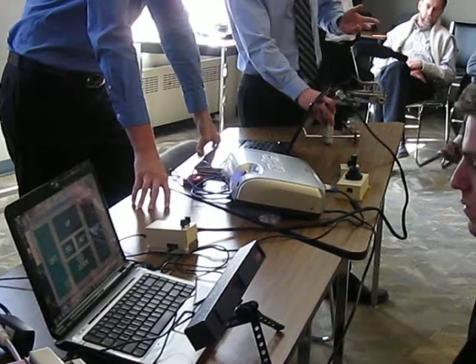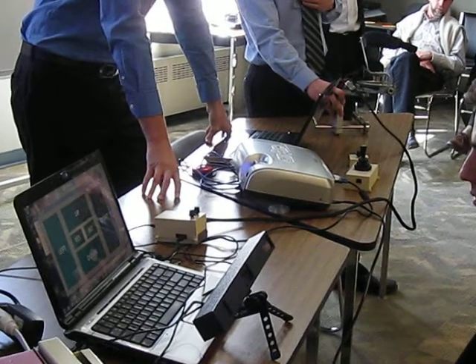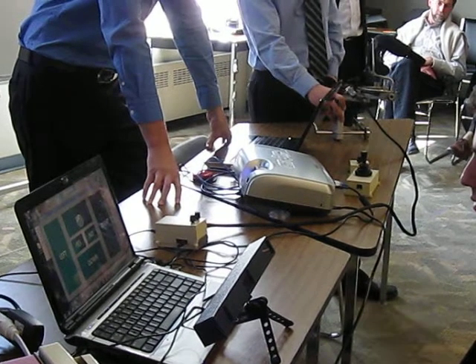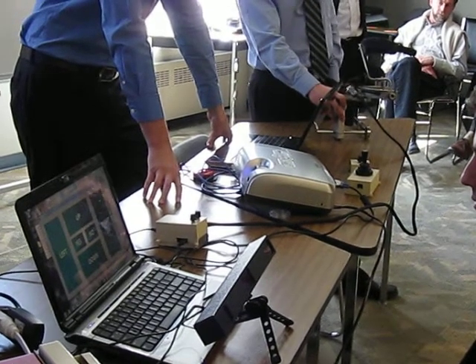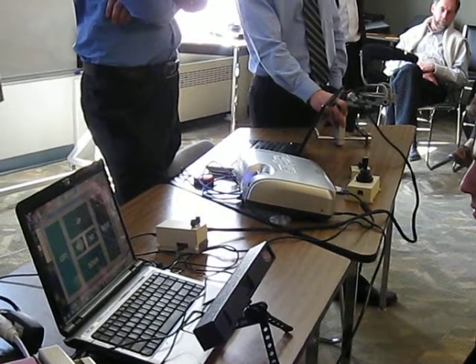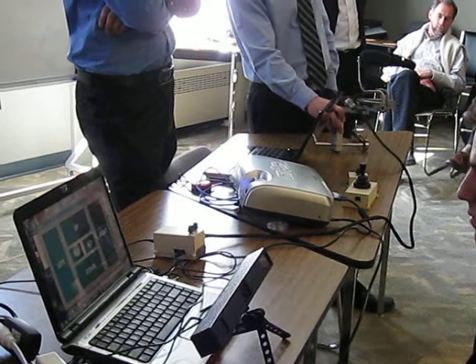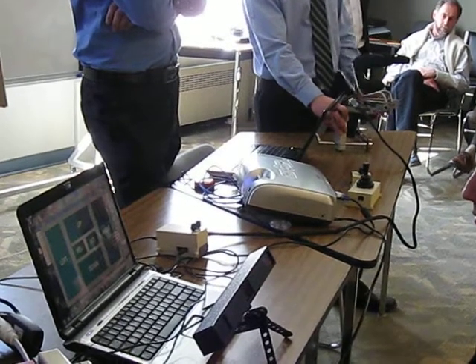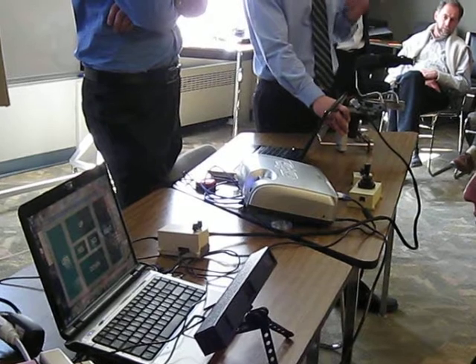You need an assistant to help you out of that position — to basically take this out. You basically have to take the device off. Like we said before, it is fairly easy to attach and dismount from a wheelchair. So you would need assistance; however, you would not cause further damage. You're just literally stuck in the position that you were at.